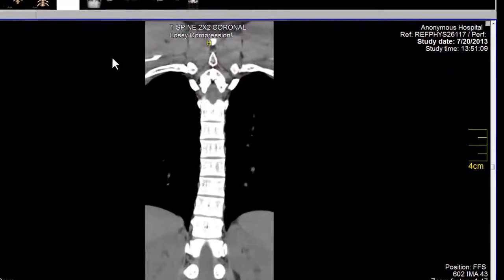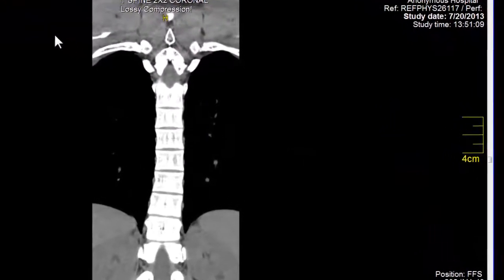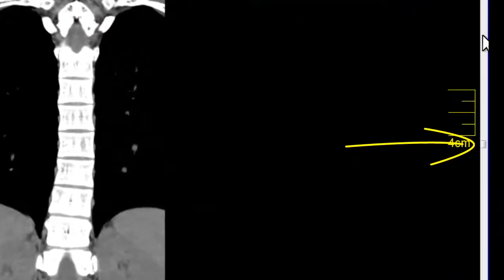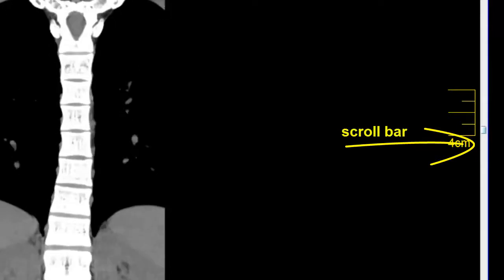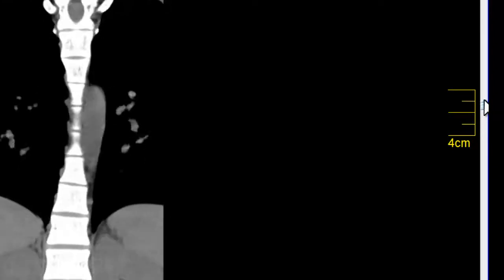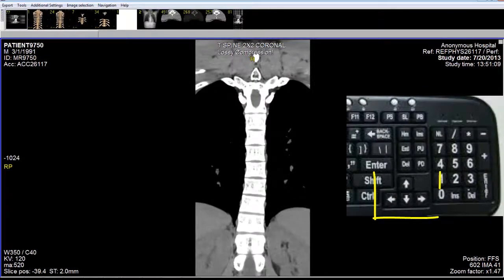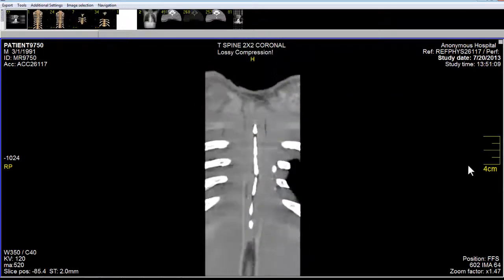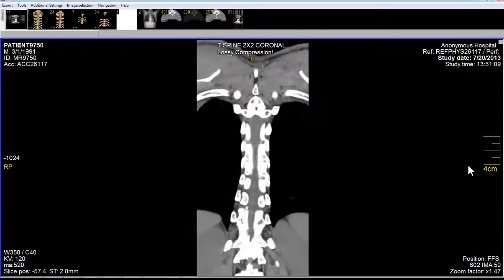You can see it is indeed a coronal stack. I can also scroll through the images by moving my cursor all the way to the bar on the right and simply pulling down or pulling up — that's the second way. Or I could use the cursors on my computer, the up and down arrows. If I push down, I go down through the stack; if I push up, I go up through the stack.